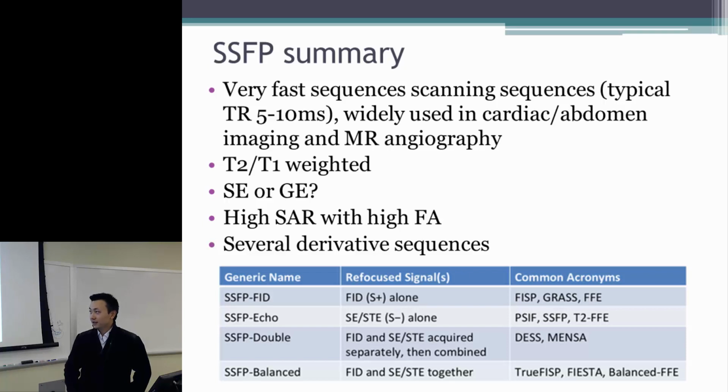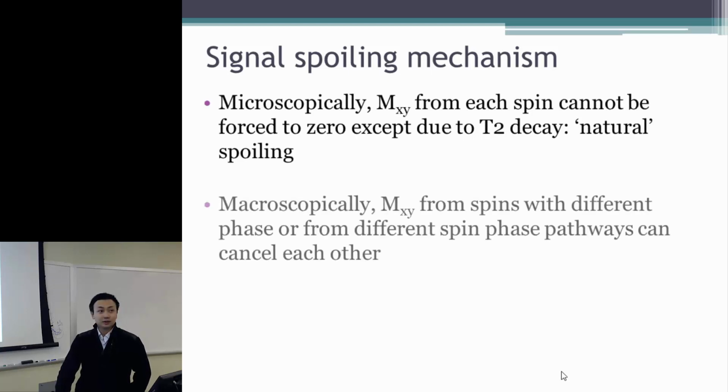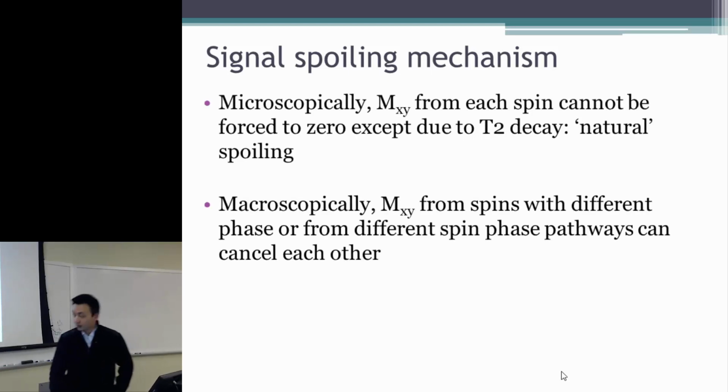And also there are several derivative sequences, as we said before. There is the FISP, PSIF, TrueFISP, Fiesta, something. So if you are interested, you can just look them up. Okay, so the last part.